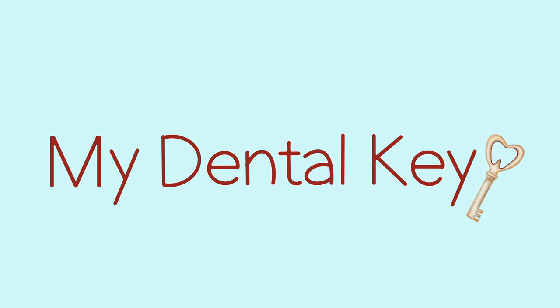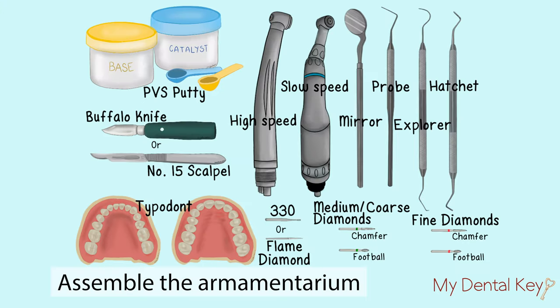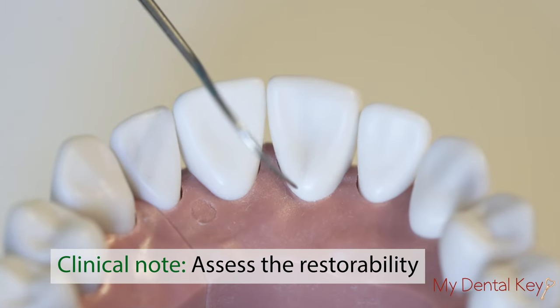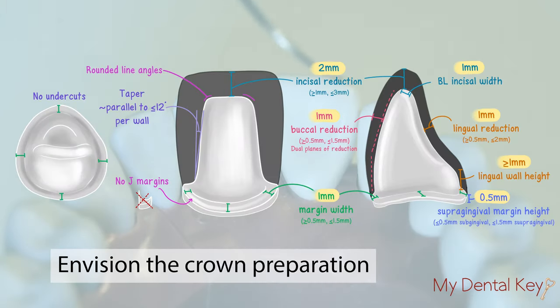This video will cover a maxillary central incisor number 9 all ceramic crown preparation. Assemble the necessary instruments and materials as shown in this illustration. As a clinical note, before you begin, assess the overall restorability of the tooth. Envision the crown preparation and familiarize yourself with the adequate dimensions for crown reduction.